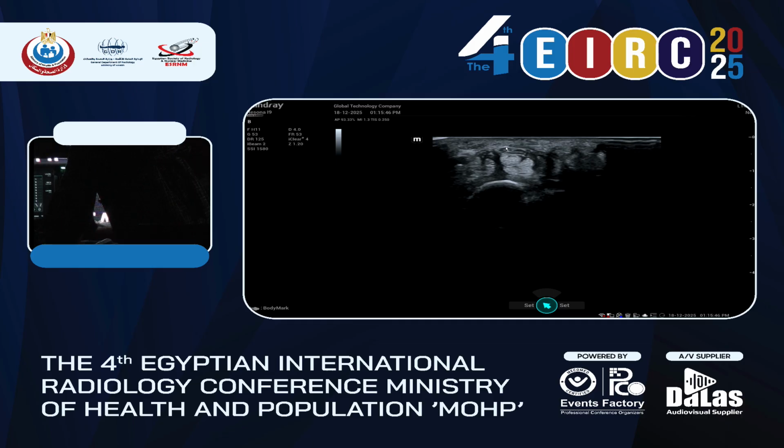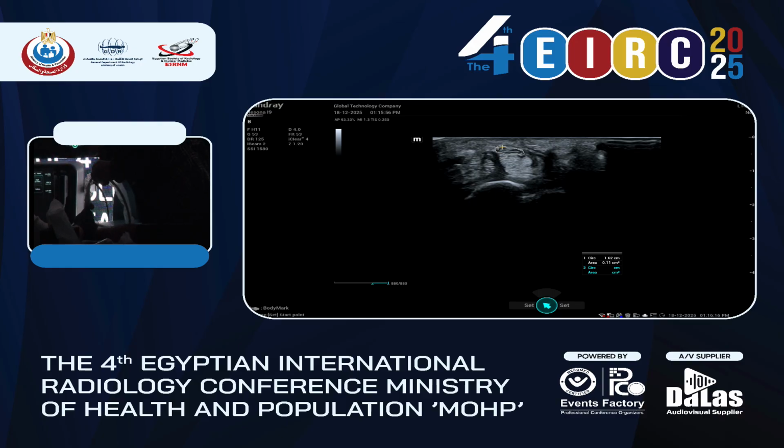This is the epineurium, the bright line. Cross-sectional area, calipers, and then trace. I put freeze because otherwise I cannot. Caliper, trace. So we come here and we measure inside the echogenic epineurium, like that. Not the bright line, inside the bright line. Here it is 11 square millimeters, which is totally normal. Up to 11 square millimeters is considered normal.